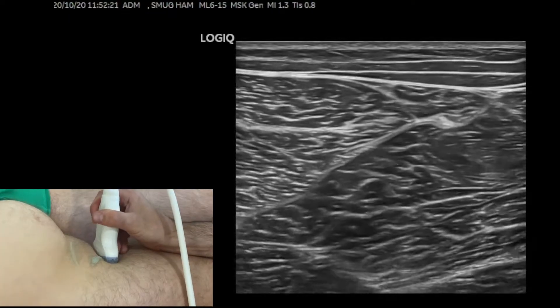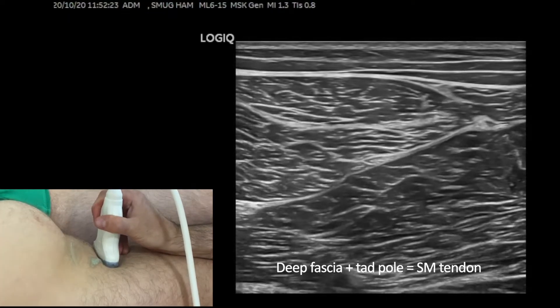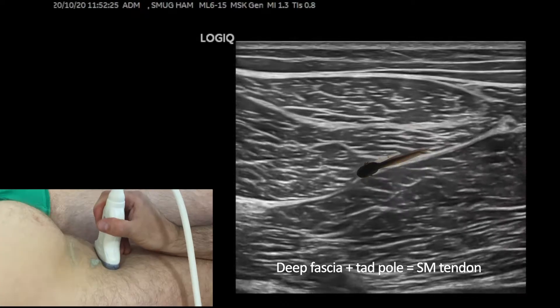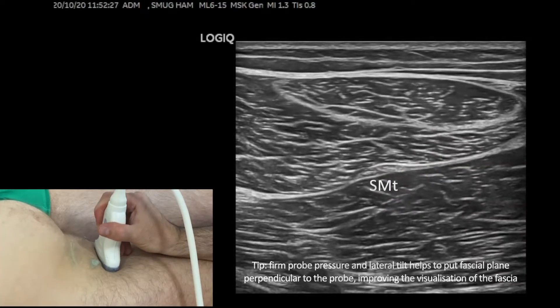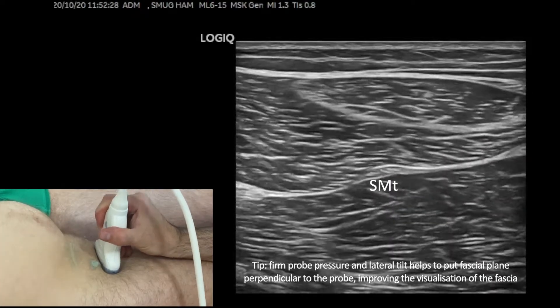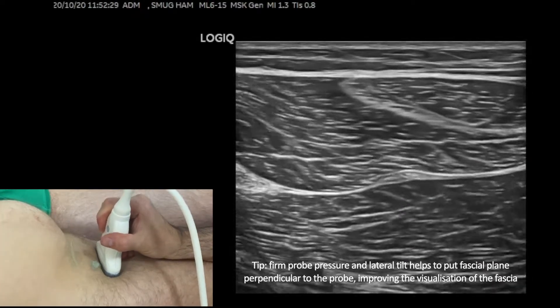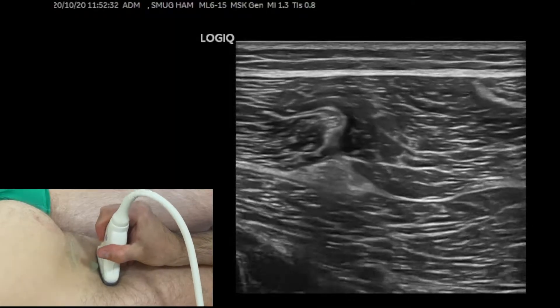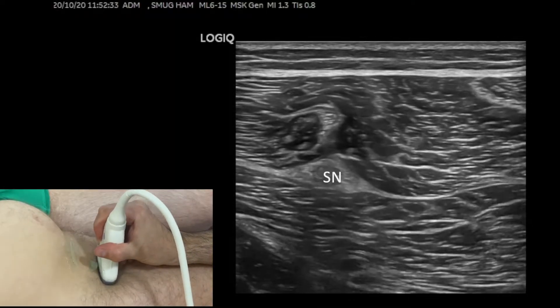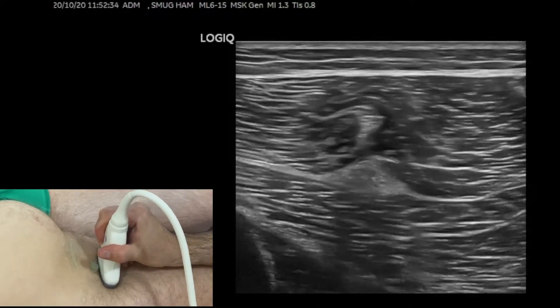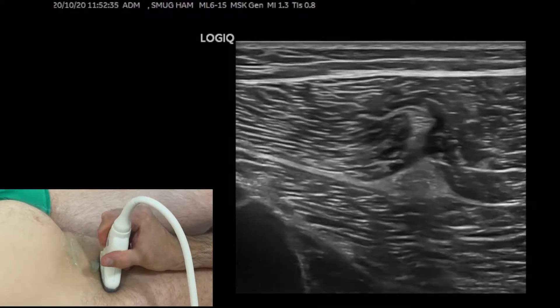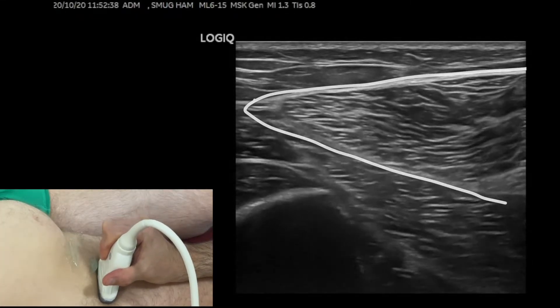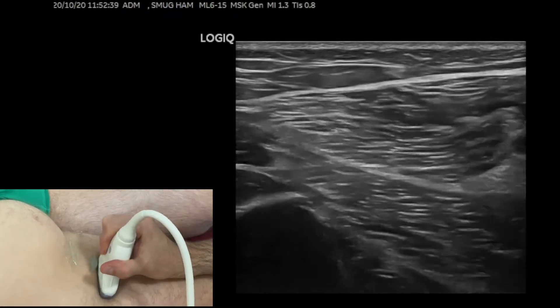We follow the deep fascial plane and then there's a teardrop-like nodule in the fascial plane, which is the semimembranosus tendon. We then follow up further laterally and the next structure you see is the sciatic nerve in the fascial plane. We follow the fascial plane all the way to the lateral side until the end of the compartment.